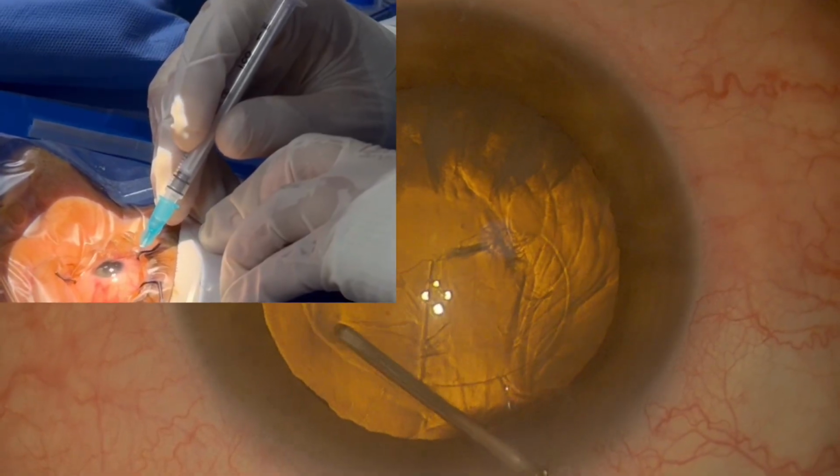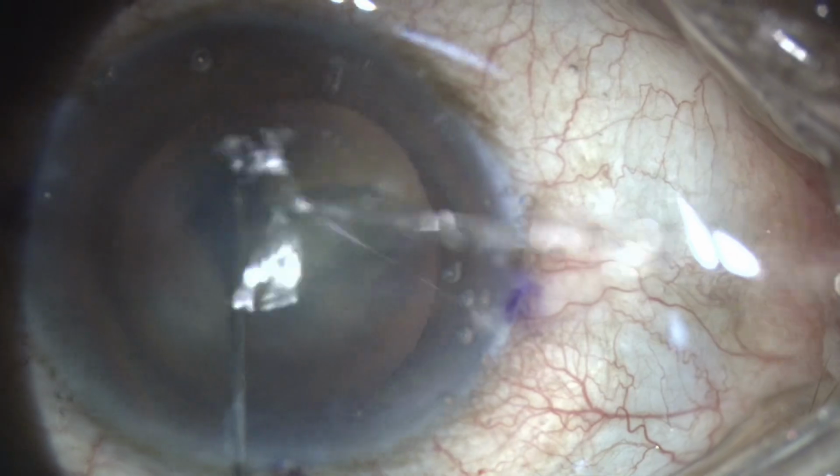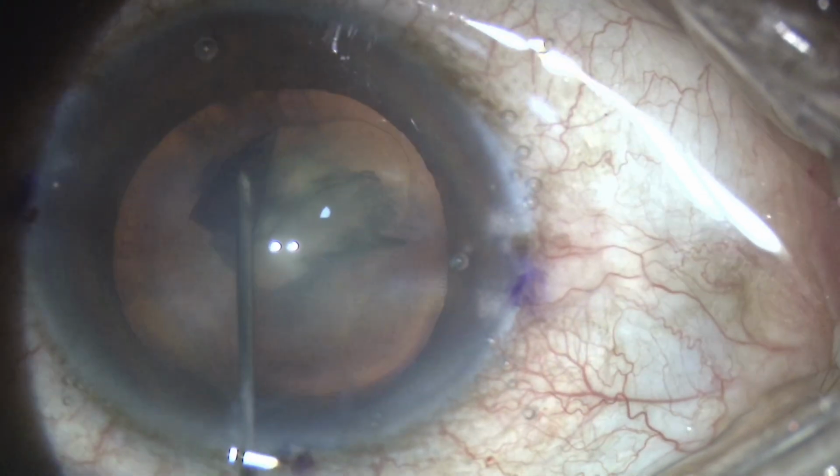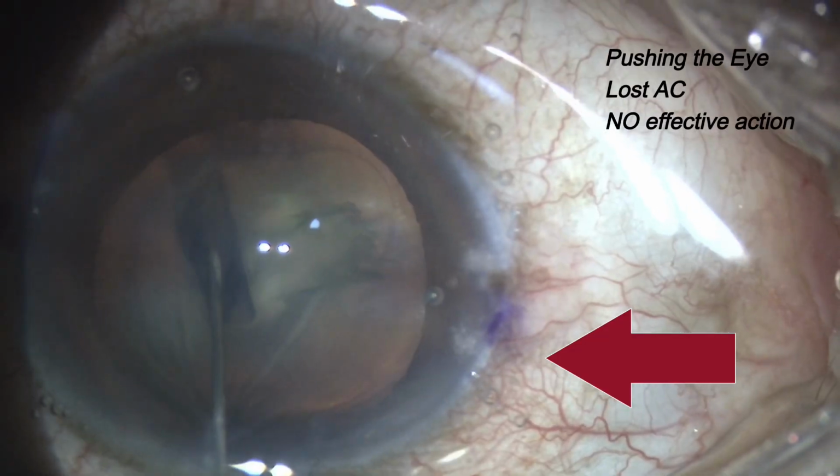So what will happen if you don't change the angle and follow the rule? You will end up trying to push the wall of the incision with a very strict movement, collapsing the AC with no significant effect at the end.